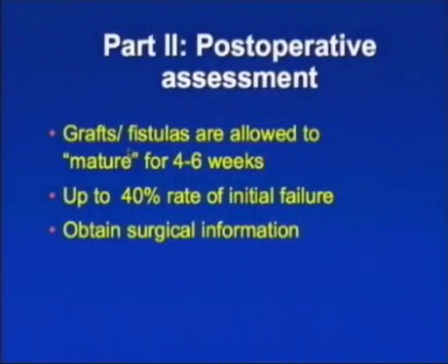For the postoperative assessment, it should be kept in mind that for up to 40% of these grafts or fistulas, there's an initial failure rate, so the grafts will not go on to maturity. One of the most important pieces of information for us prior to scanning the graft or fistula is to obtain the surgical information. Just a quick anecdotal story. I spent 45 minutes scanning someone's loop graft down on the forearm and found it was totally occluded by the time I figured out the hemodynamics, etc.